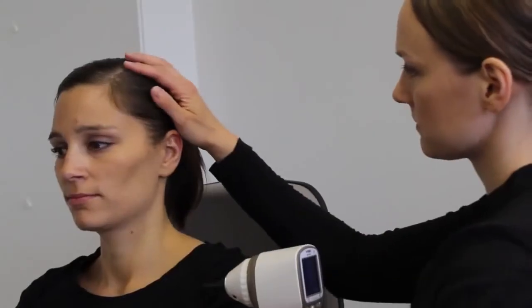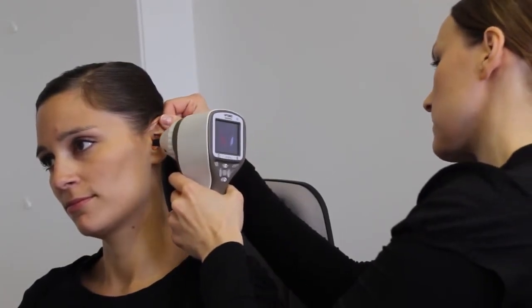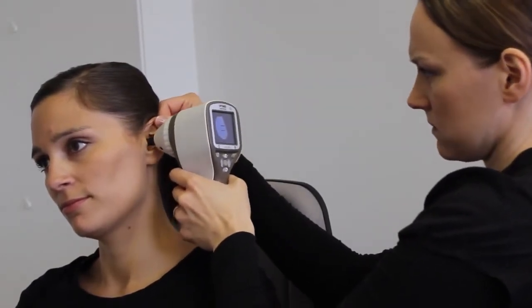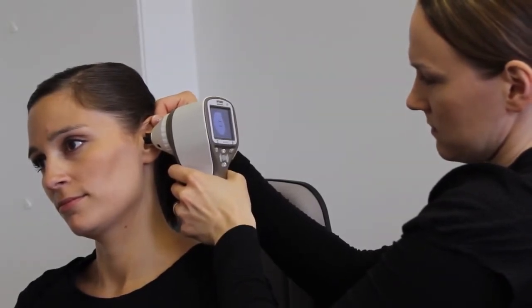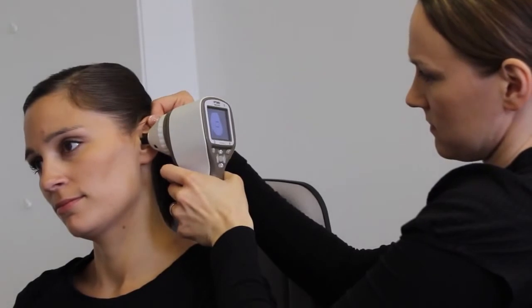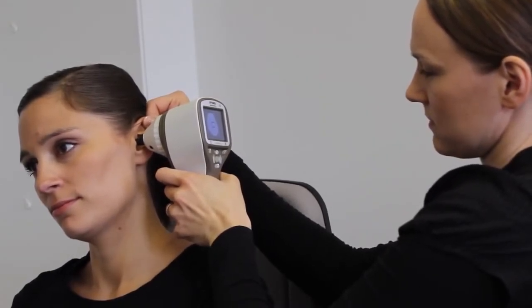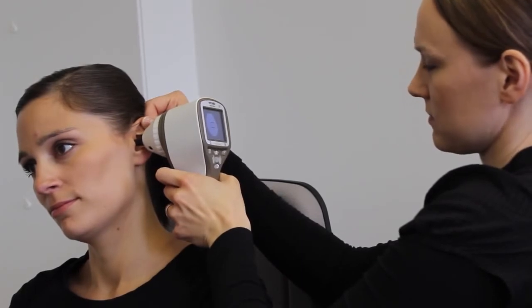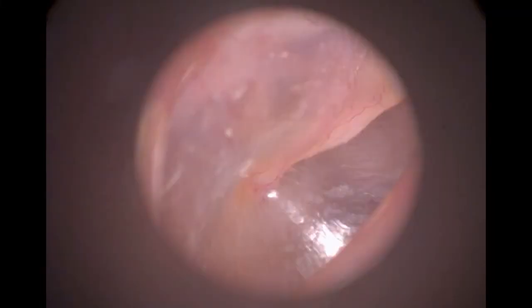The patient is asked to tilt their head away from the doctor. Gently pull the ear pinna upwards and back and insert the speculum directly into the ear canal. If needed, activate the zoom by pressing the right soft key. Use the arrows up and down to adjust the zoom level. Capture the image by pressing the shutter button. In order to ensure good quality of examination, take multiple images.